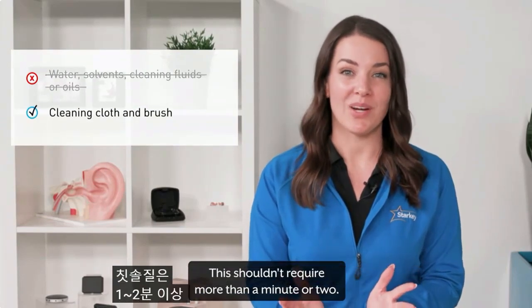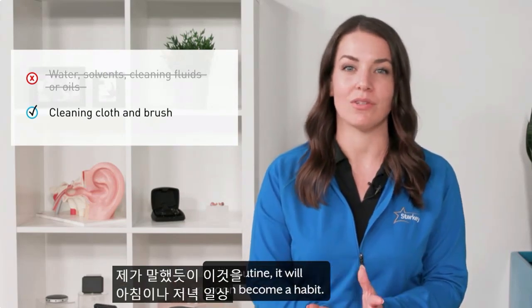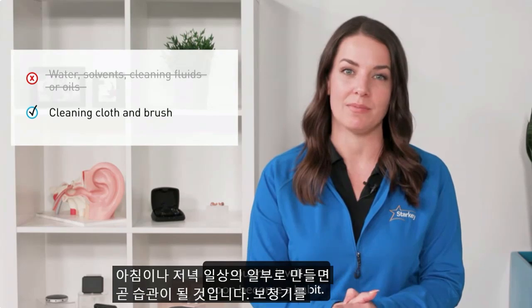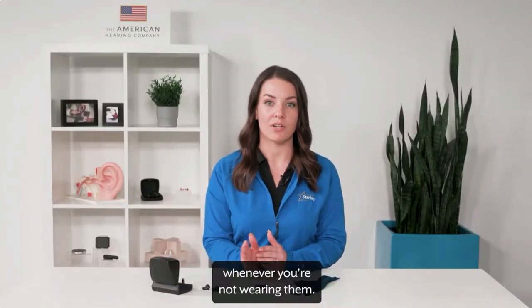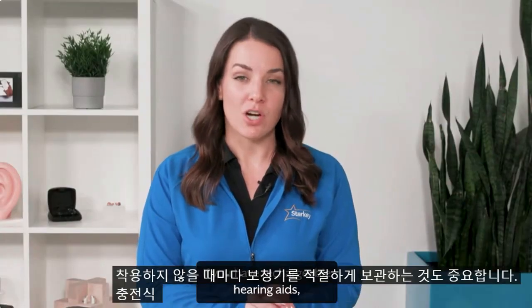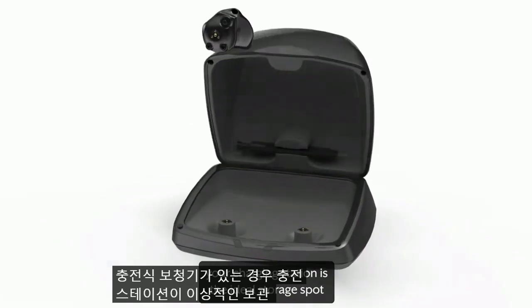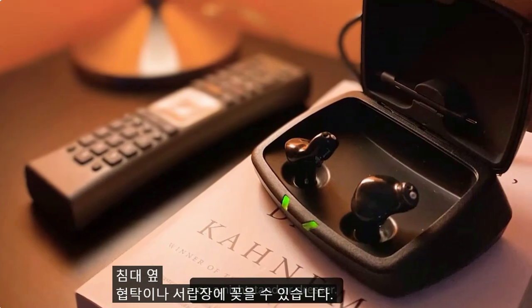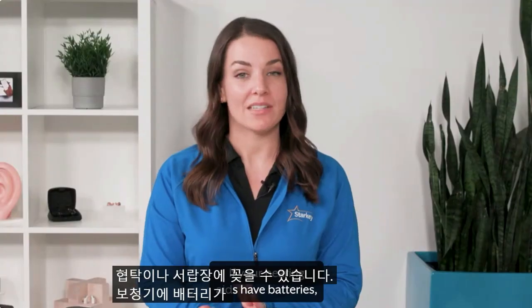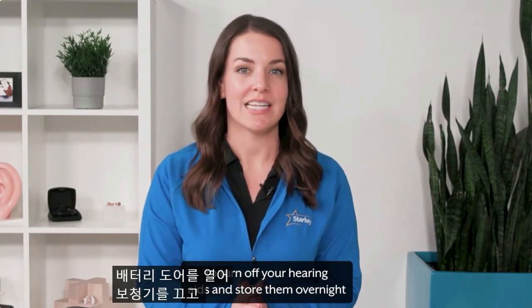This shouldn't require more than a minute or two, and like I said, if you make it part of your morning or evening routine, it will soon become a habit. It's also important to store your hearing aids properly whenever you're not wearing them. If you have rechargeable hearing aids, your charging station is the ideal storage spot and can be plugged in next to your bed, on a nightstand, or dresser. If your hearing aids have batteries, make sure to open the battery door to turn off your hearing aids and store them overnight in a safe place.